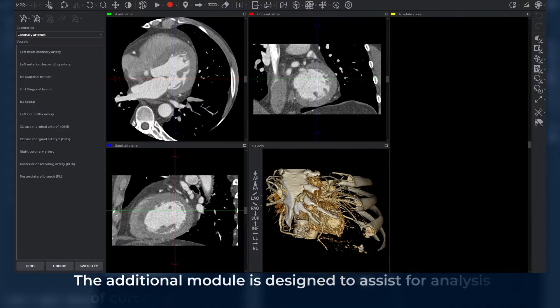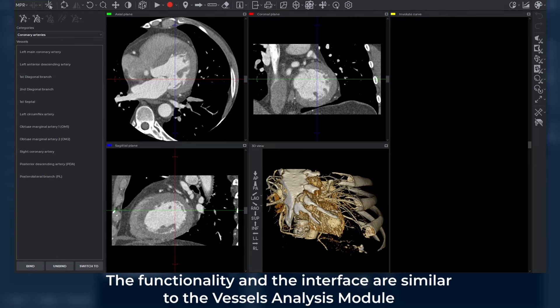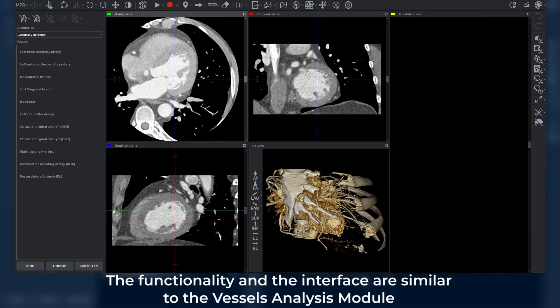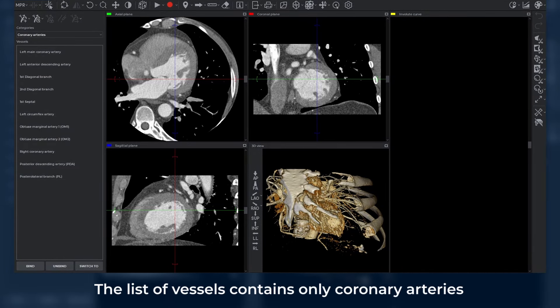The InnoBtech DICOM Viewer Coronary Arteries Analysis Module is an additional module designed to assist with analysis of coronary arteries based on enhanced CT studies. The functionality and interface are similar to the vessels analysis module, and the list of vessels contains only coronary arteries.